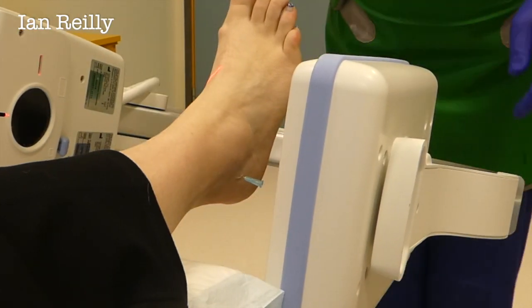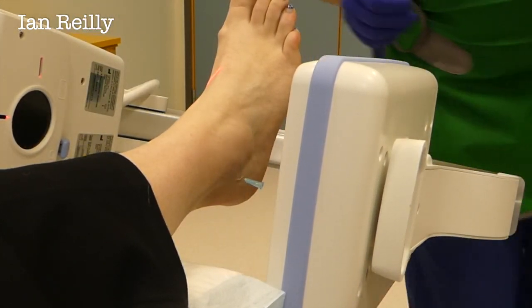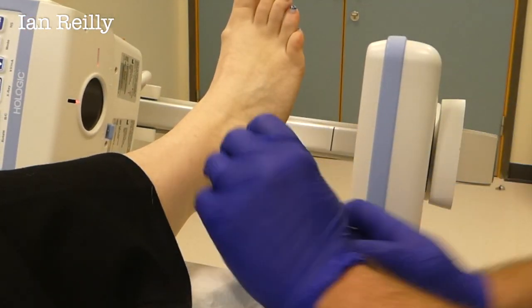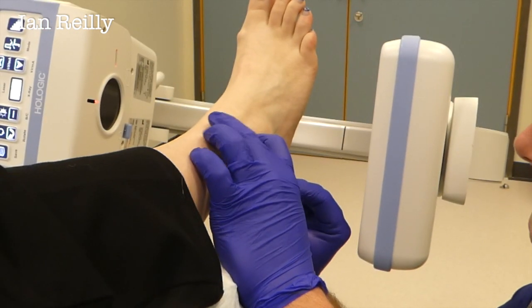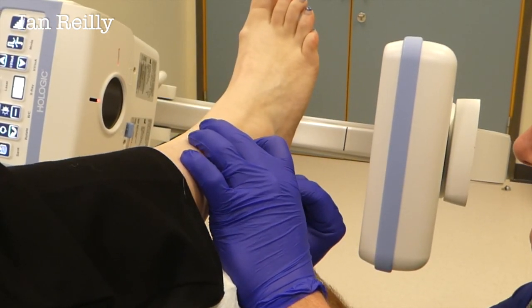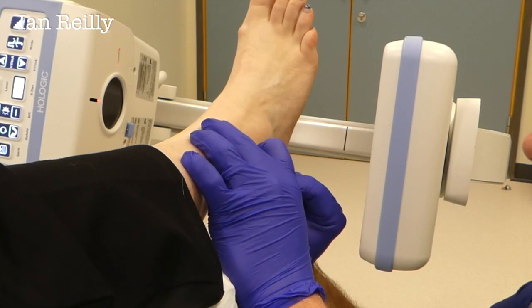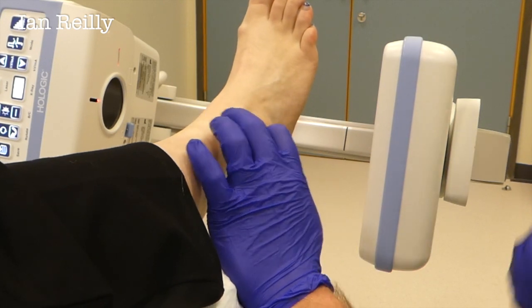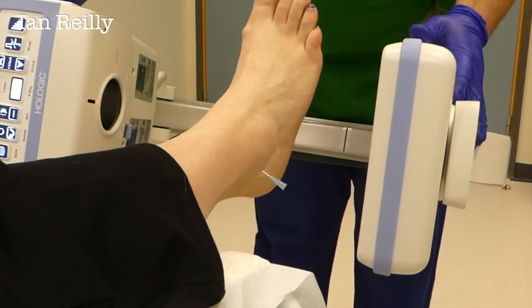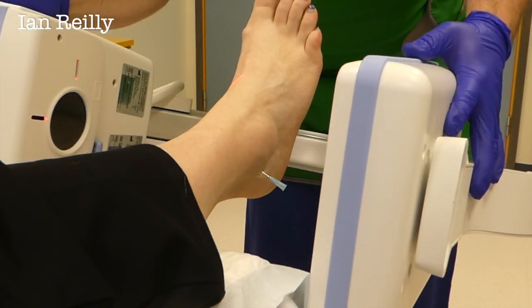Almost there. This was the bit we're talking about in the back there. I'll come in a little bit. That first pass with the needle was just a little bit posterior. Can you see that little bump just on the screen there, just down there? That's what we're firing at.